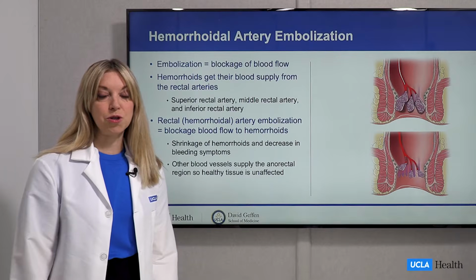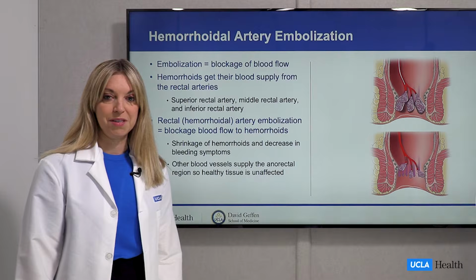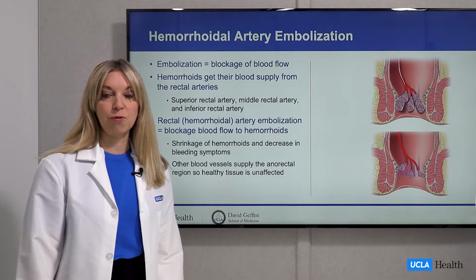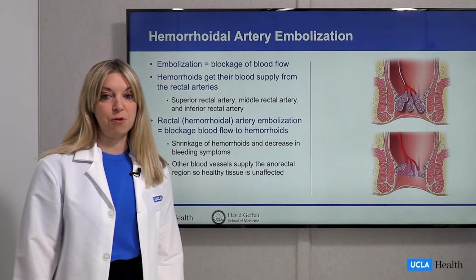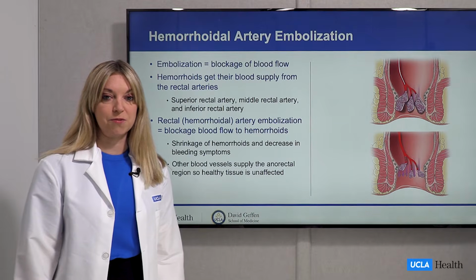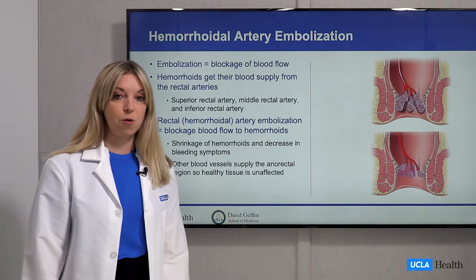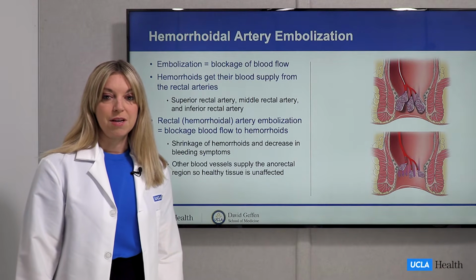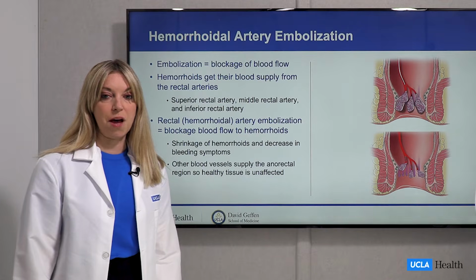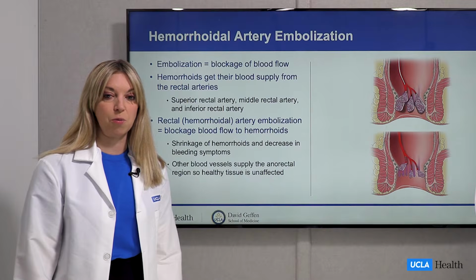Now that brings us to our treatment that we want to discuss with you today, which is called hemorrhoidal artery embolization. Embolization in general refers to the blockage of blood flow within a vessel. And embolizations have been performed by interventional radiologists for decades to stop bleeding in other parts of the body. In 2014, the same technique was first described for treating internal hemorrhoids. These receive their blood supply from the rectal arteries, so embolizing some of these vessels can reduce the blood flow to the hemorrhoids and treat bleeding symptoms.